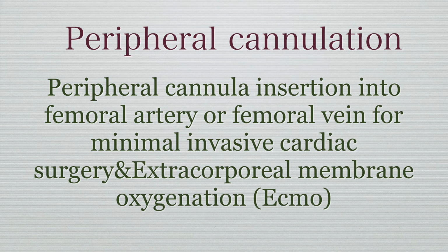Peripheral cannulation: peripheral cannula insertion into the femoral artery or femoral vein for minimally invasive cardiac surgery and extracorporeal membrane oxygenation, ECMO.